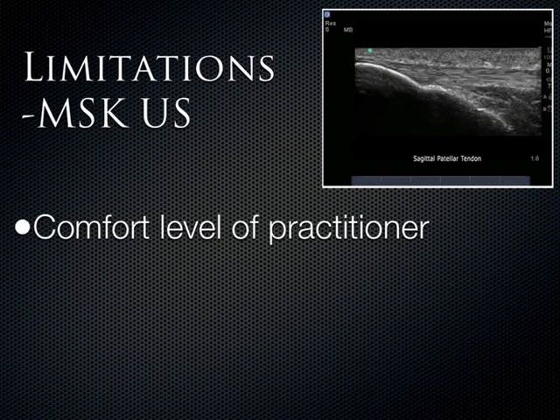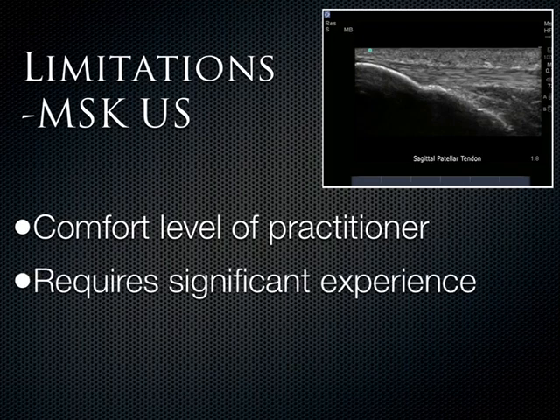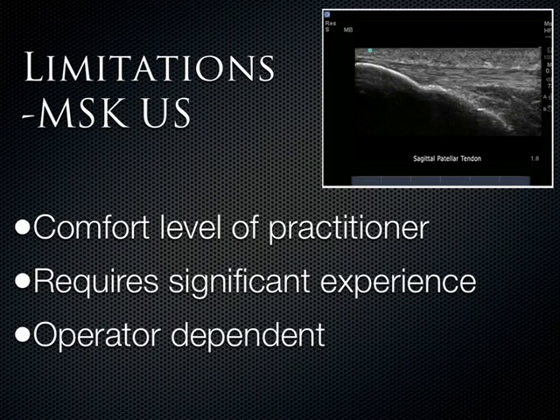Now, limitations are really about making you comfortable. And that's why we integrate ultrasound into the four years of medical school here, so that by the end of medical school, you feel like ultrasound is a natural extension of what you do. It's just part and parcel. You feel confident behind it. And that requires experience because it can be quite operator dependent.